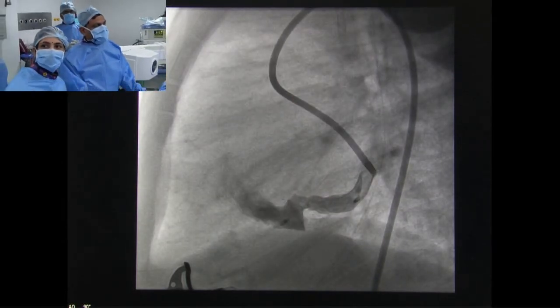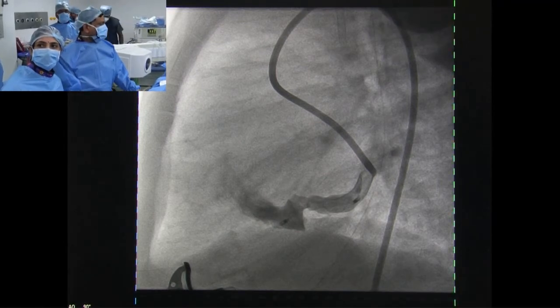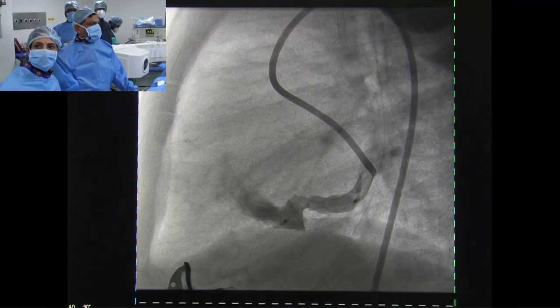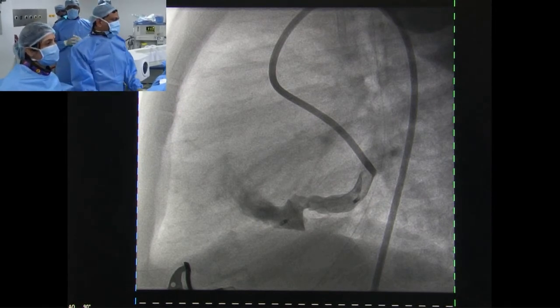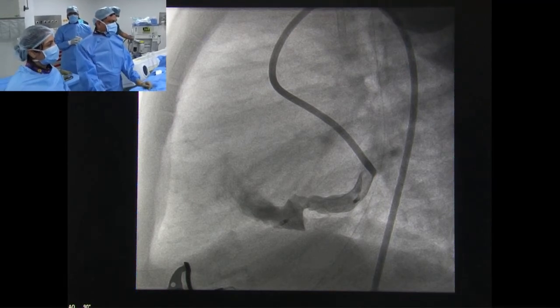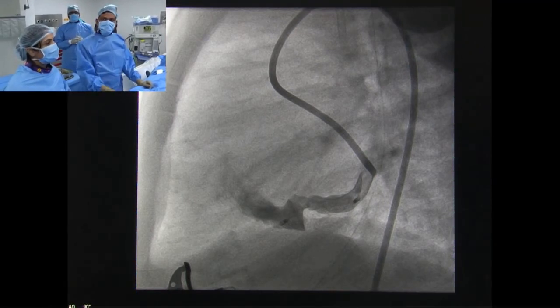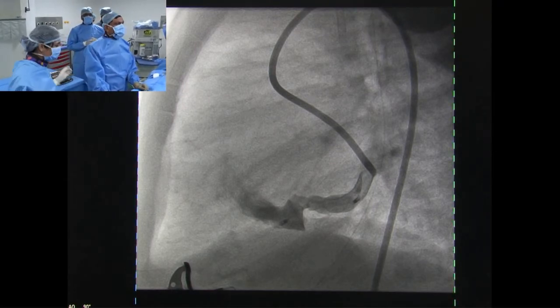AVP4 is what I would have used. Okay. I would have used the AVP4 6 or 8 mm, and I would have had one Hershey chocolate inside the right ventricle, in the right ventricular side, and one Hershey chocolate will be inside on the left side. Yeah. And usually with that, between the two discs, you can get a reasonably good occlusion.